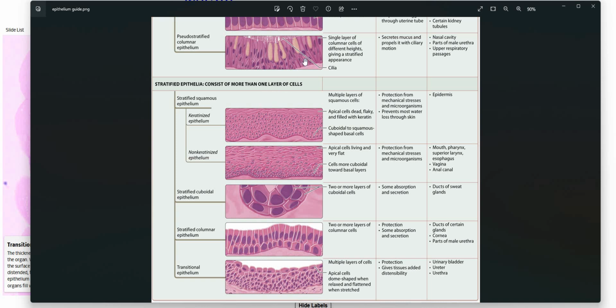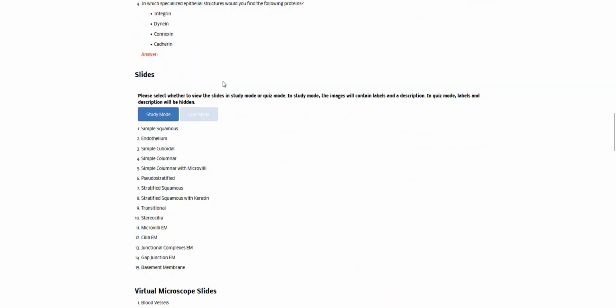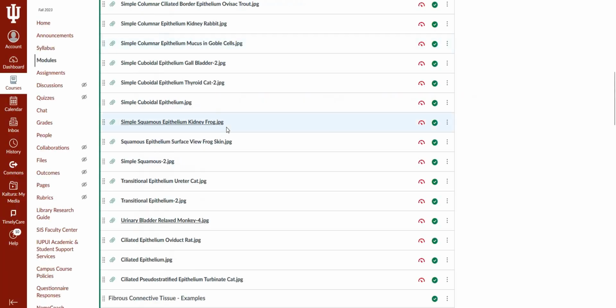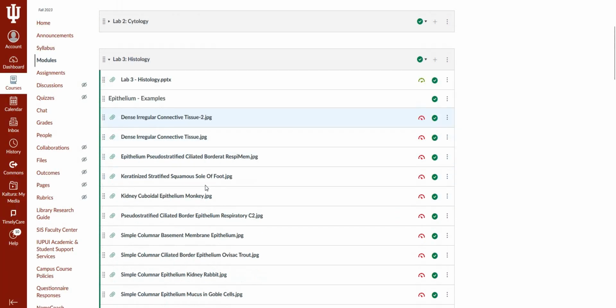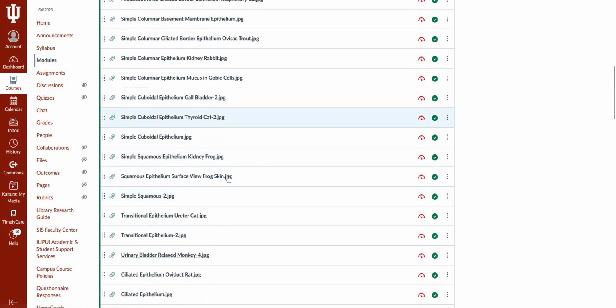So that is it for this video. Next up will be connective tissue, but I highly recommend checking out Yale's histology site. If you're looking for slides, you just need to scroll down a little bit and then you can click on all of these links here. And then we have tons and tons of examples listed here. I'll make sure to add a stratified cuboidal so you can have an example of that as well.